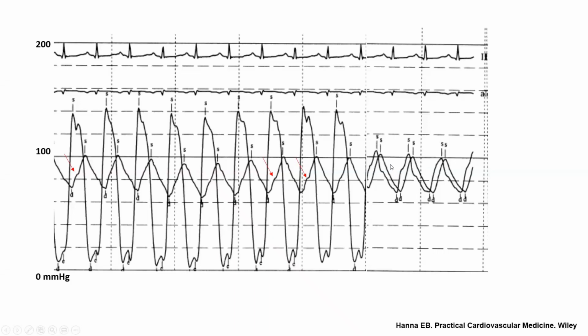So we pull back, and when you pull back, evidently your pressure should be equal across both transducers. The aortic pressure should be the same across both transducers. And that pullback maneuver is very important because it unveils whether you've been having problems in your recording. Let's say you pull back and the 2 aortic pressures are not superimposed, then you know you had an error in zeroing. Basically, the 0 level of both transducers was not correct, or you had an error in damping. Those are the 2 big errors that can occur, and I will explain those. Okay. In this case, the 2 pressures were almost superimposed, which retrospectively confirms that our recordings were accurate.